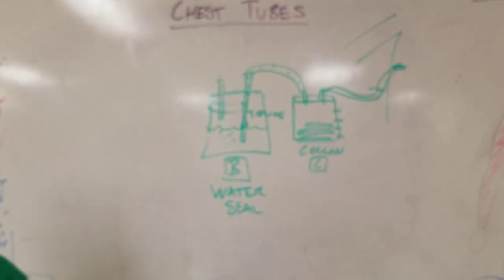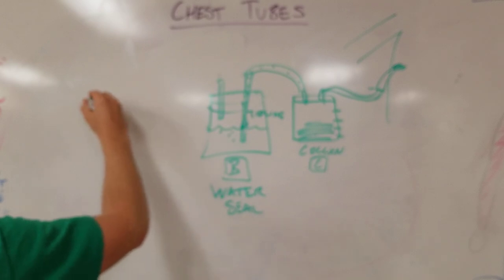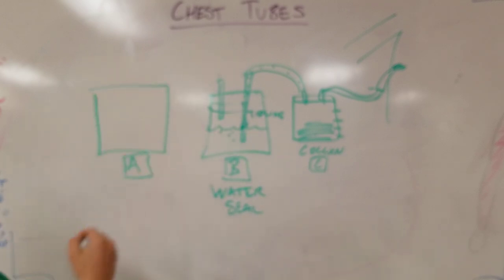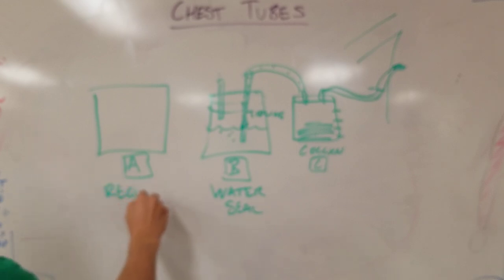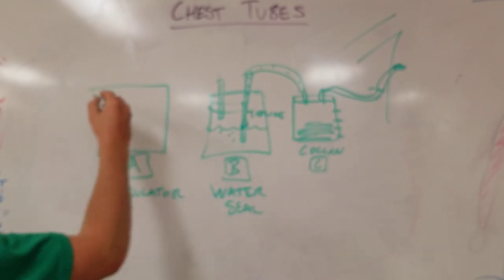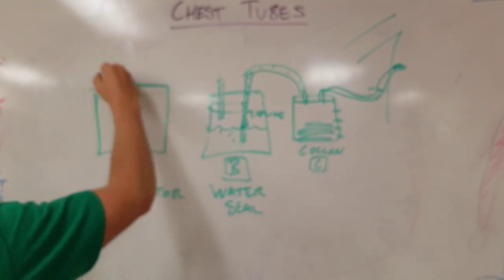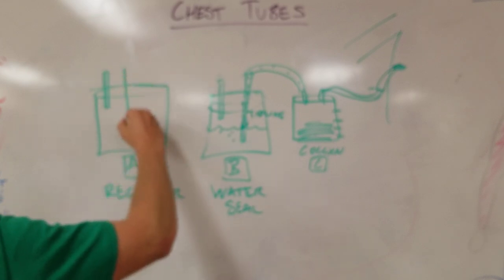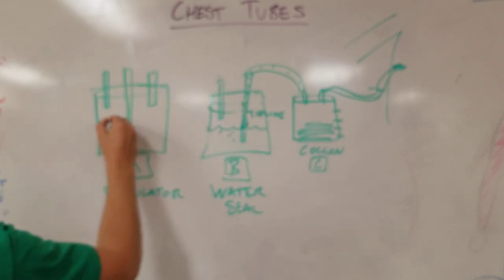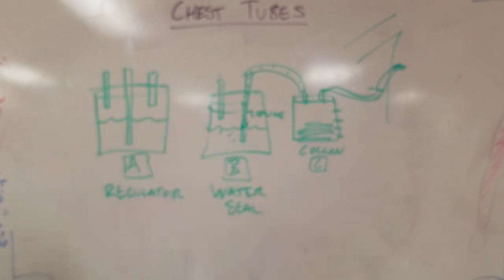And now, last but not least, we have one more chamber to go, and we've done our entire system. This is the Alpha chamber, okay? It's a suction regulator. This is the most complicated one, the hardest one to memorize, but we're gonna do it no problem, all right? This is another cork. This guy has three pipettes, boom, boom, and boom. And there's a water level in here, just like in the Bravo chamber.